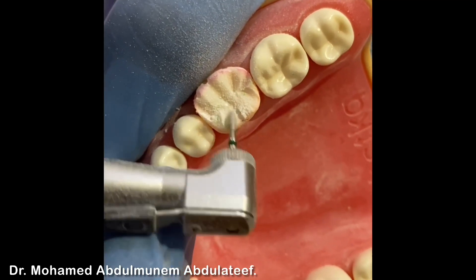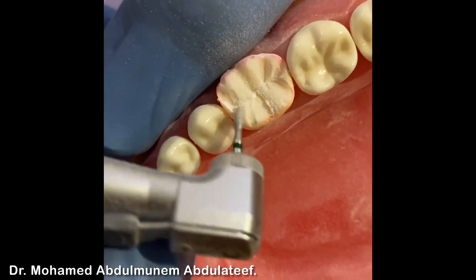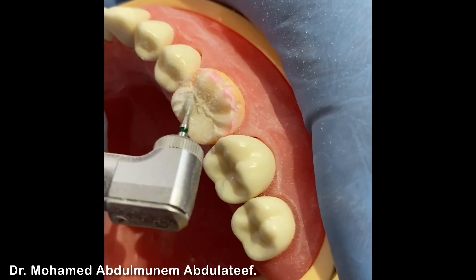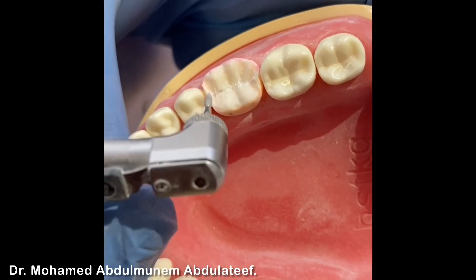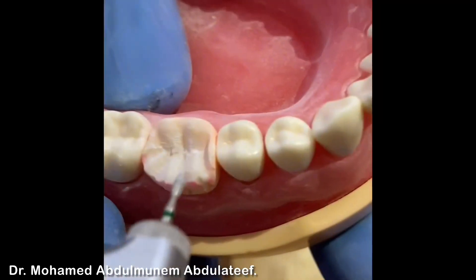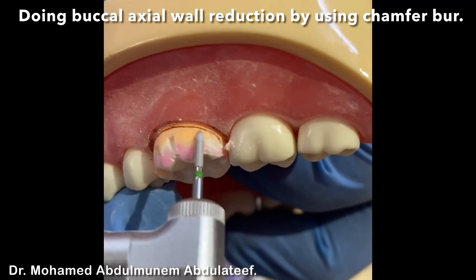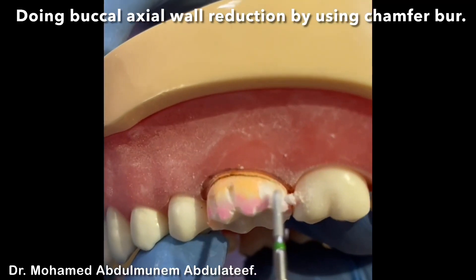Be careful not to hit the adjacent tooth. The border will be the developmental groove. Now we do the axial reduction with the chamfer bur — start from this side and go carefully. Be careful not to hit the gingival margin, and your bur should be parallel to the long axis of the tooth.